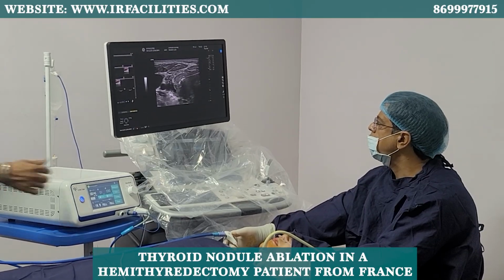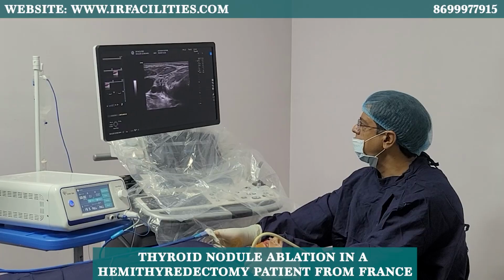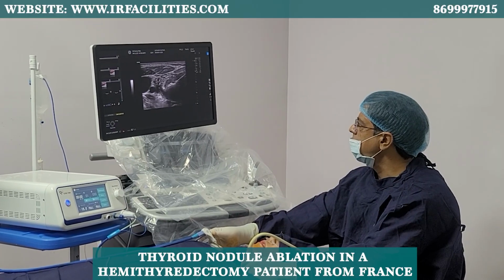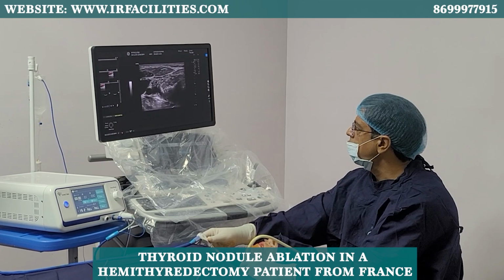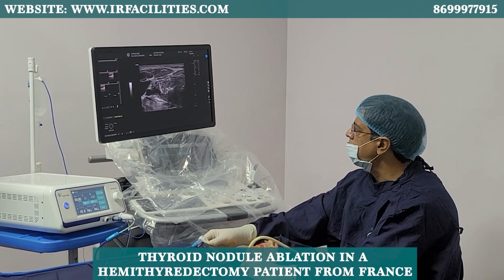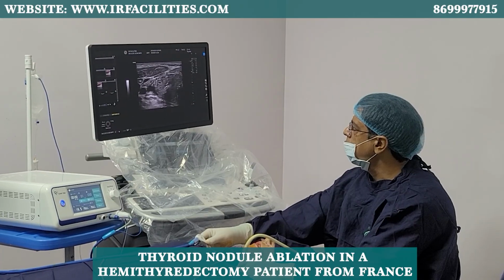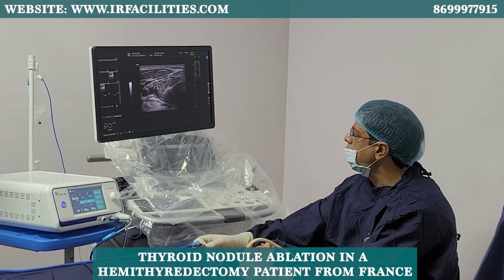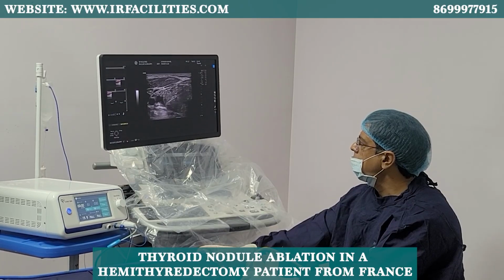This is painful. This was close to surface. I've stopped it. Now the pain will go. Again, it's close to surface.